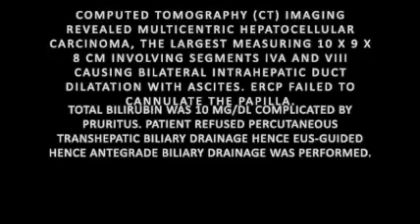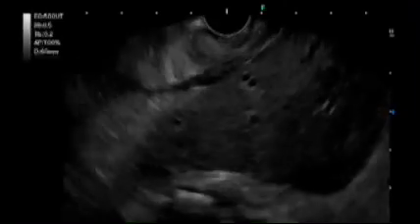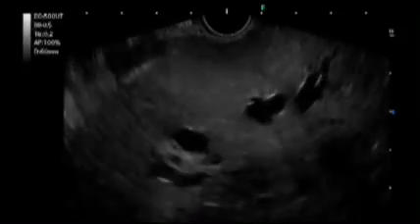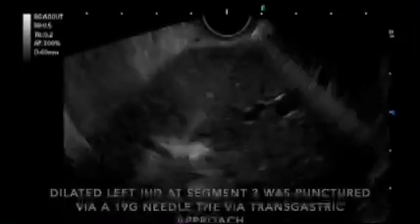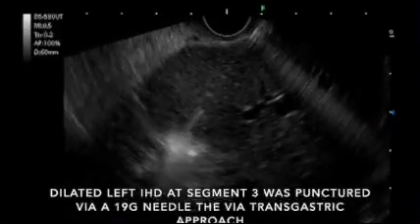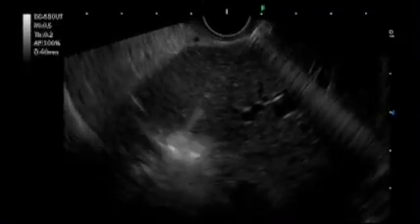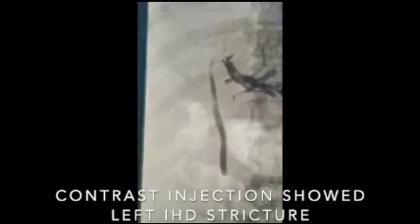He refused a PT-BD, hence an antegrade biliary drainage was performed. EUS demonstrated IHD dilatation with the presence of ascites. The dilated left IHD at segment 3 was punctured via a 19-gauge needle at the transgastric root. After this, contrast was subsequently injected, which demonstrated a left IHD stricture, as shown.